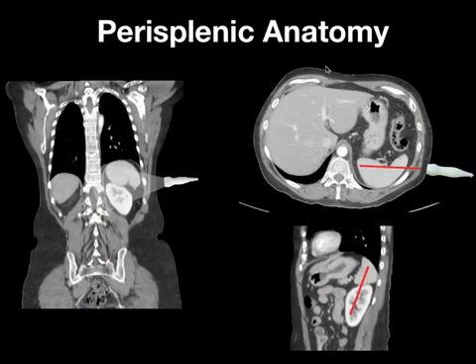Using CT scans, here you can see what the image is going to look like. You get your transducer here, intercostally oblique, indicator up this way, and you're going to be shooting in through the intercostal space. Here's the spleen, here's the kidney, here's the splenorenal fossa, and here's the important subdiaphragmatic area that you need to see. If you take a look here, using this axial cut, you can see how you're going to be cutting through the spleen to obtain this window.